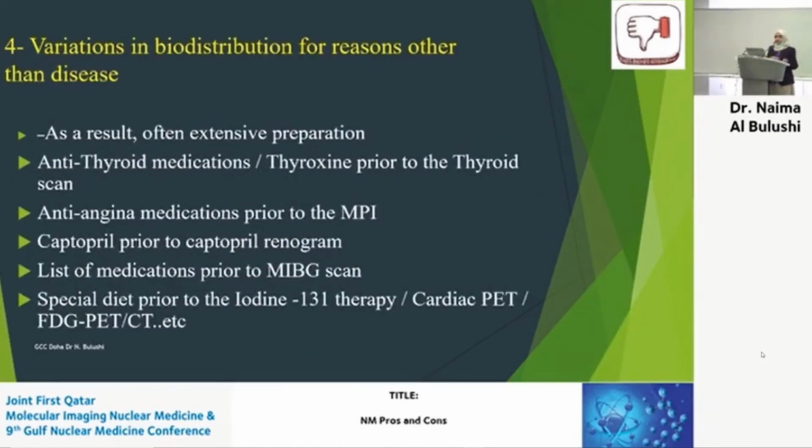The variation in biodistribution can be a reason for other than diseases, and this needs preparation. The only preparation you need in radiology is to be fasting, maybe for 4 hours, from solid food, or 6 hours, and then you are advised to drink a lot of water. It doesn't matter if you are having anti-thyroid medications, it doesn't matter if you exercised the previous day, it doesn't matter what meal you had. But when it comes to nuclear medicine, there's a lot of preparation required which will affect the biodistribution. And this is again to do with the specificity of the uptake.